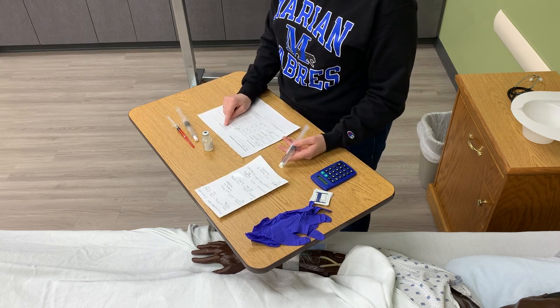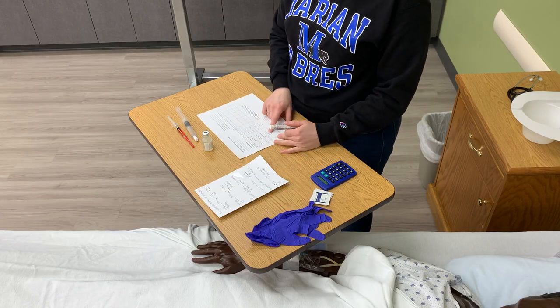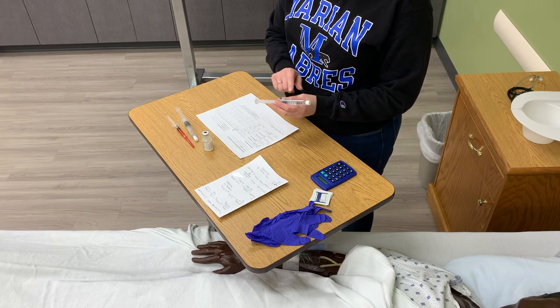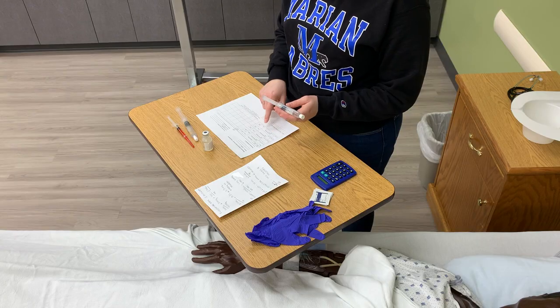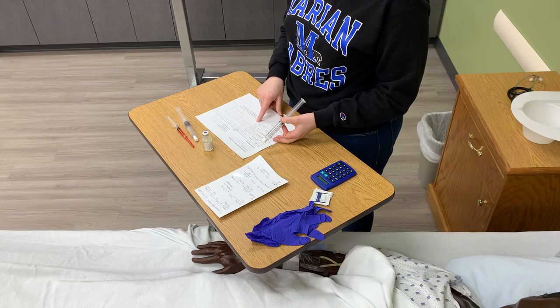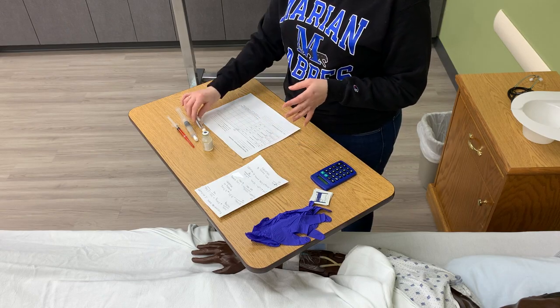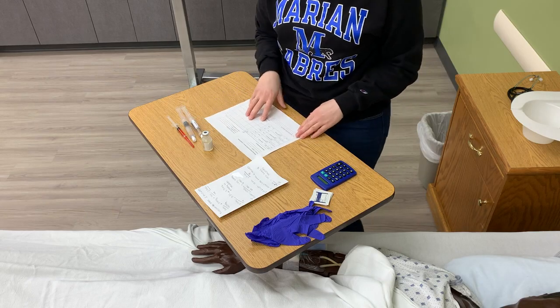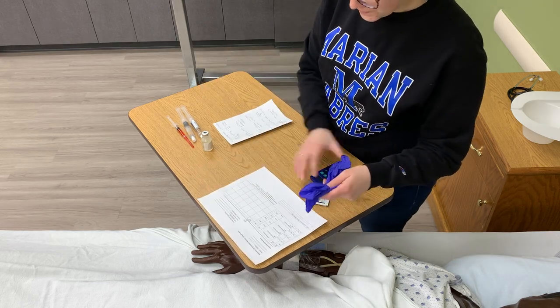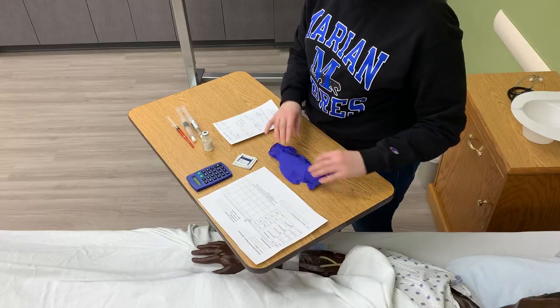Second flush, we have Casey Banks, 10/2/1965, allergy to aspirin. We have an order for 0.9% sodium chloride, IV flush. This is for IV flush, BID, dose of 10 mLs. I'm checking, I have 10 mLs here. At 0900, it has not been given today for that due time. It does not contain aspirin, it's not expired, and package integrity is intact. So MAR check 3 is complete. I've got my calculations close by. And my alcohol wipes, we already checked the package integrity in the bedroom, and I have my gloves here.